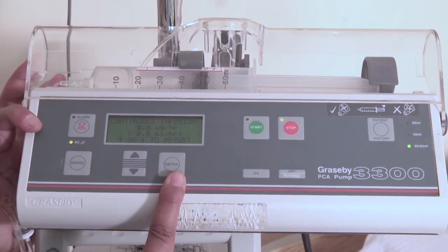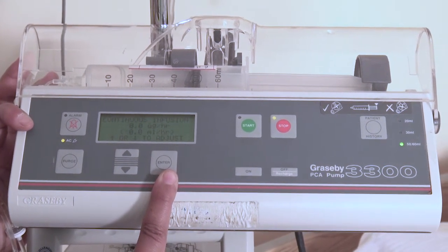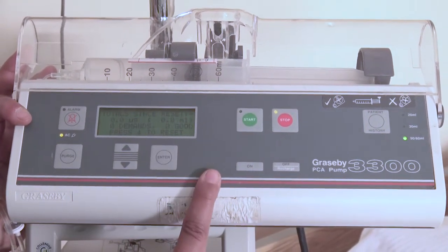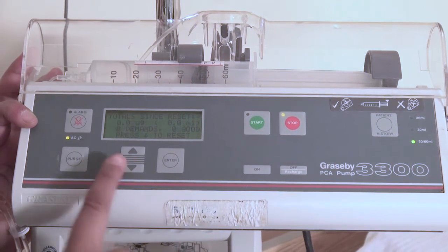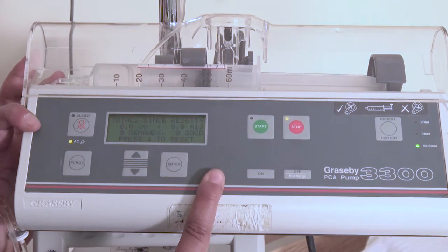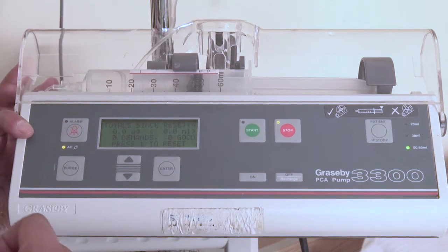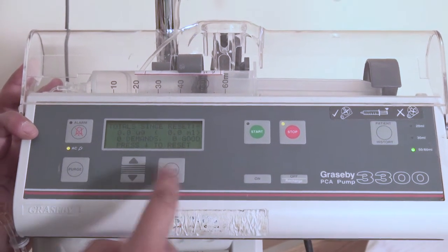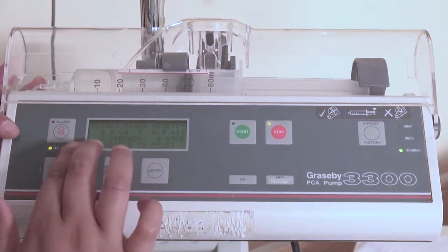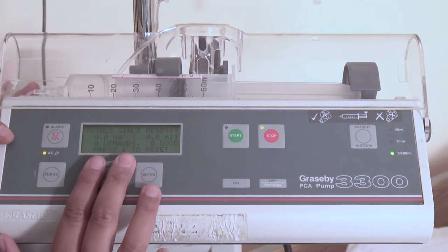Now we have a continuous infusion. The continuous infusion is if you have a dose of medication constantly infusing. Since we don't, we'll leave it at 0. The last one is total since reset. So it says 0 demands, 0 goods. What your goods and demands mean is your demands are how often they are pushing the button, and the goods is how much medication they actually received. This is a really good way to know whether or not teaching and education for your patient is necessary.